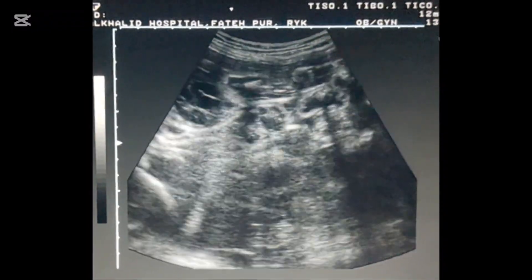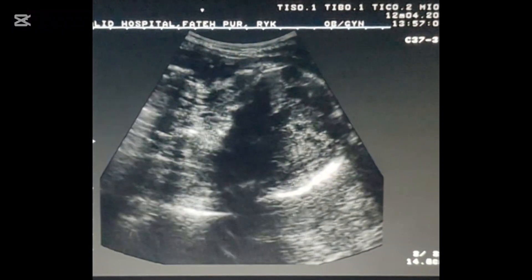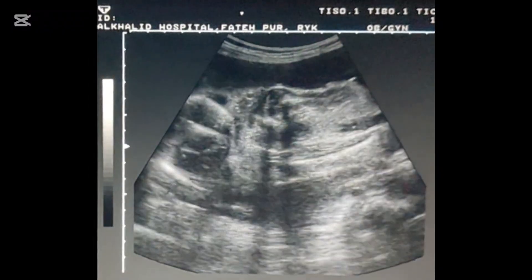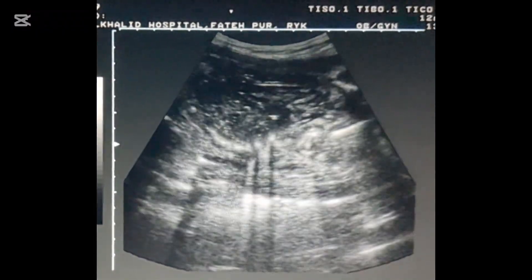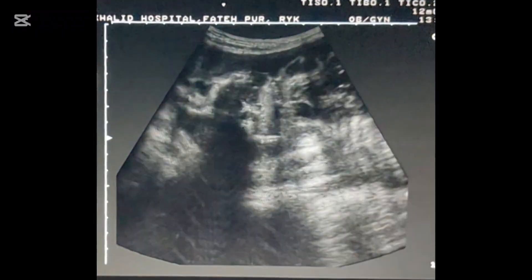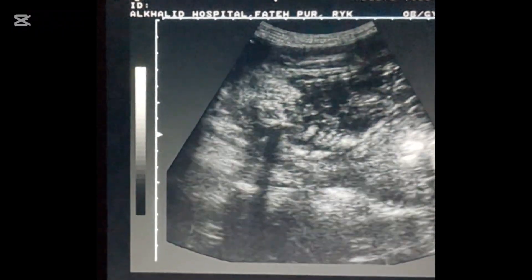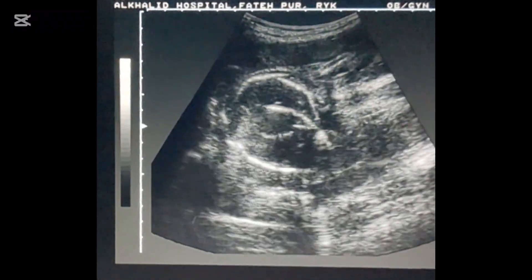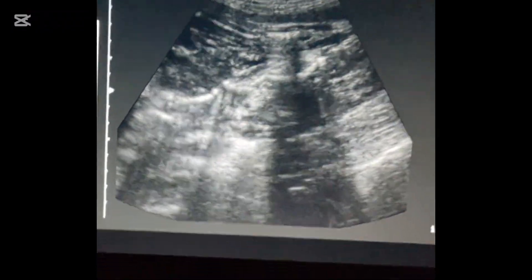These are monochorionic diamniotic twins with a pregnancy of about 32 weeks — one fetus alive and one fetus dead — with mild oligohydramnios. This is the typical presentation of Spalding sign.